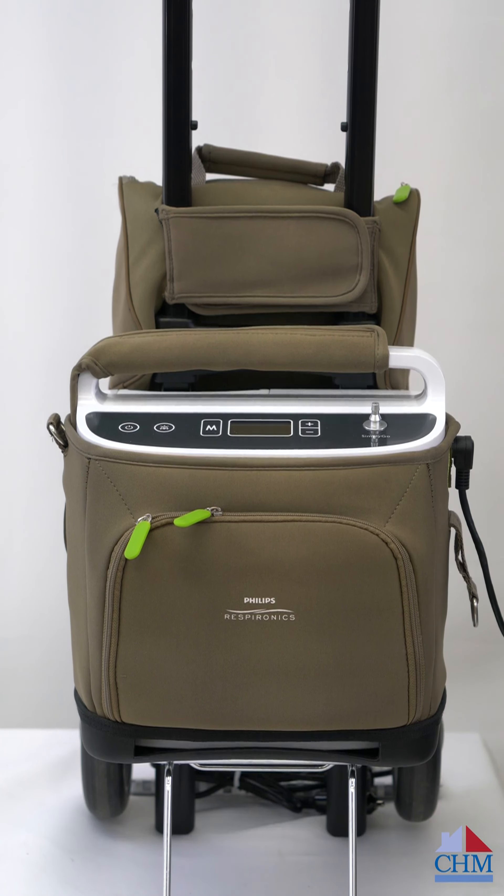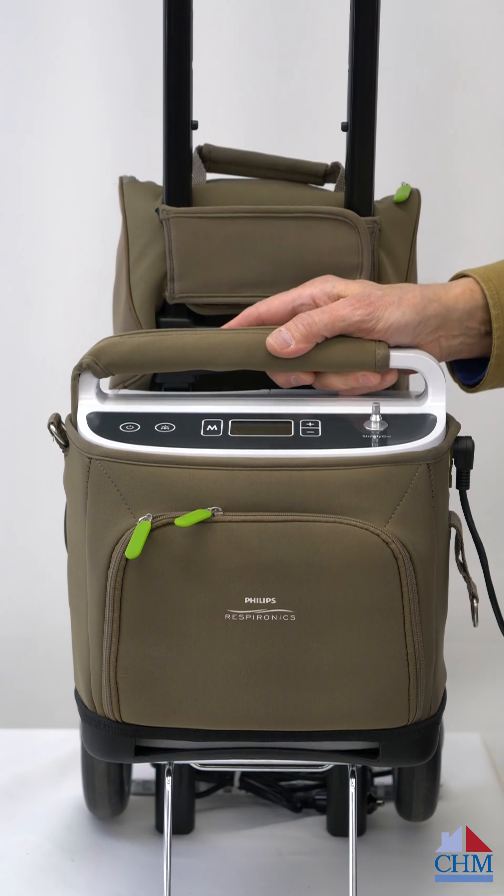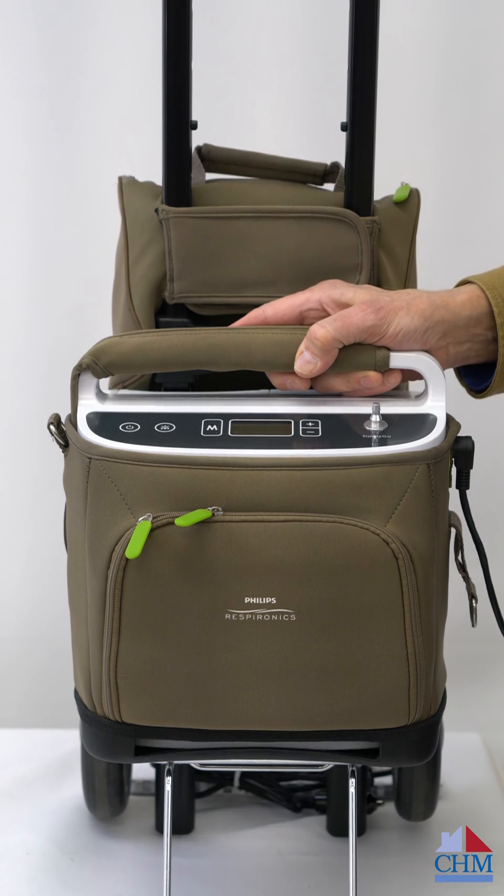This is the Simply Go POC, or portable oxygen concentrator. Make sure you don't confuse this one with the Simply Go Mini. This is the larger unit, the Simply Go. The Simply Go Mini is a smaller over-the-shoulder type unit.